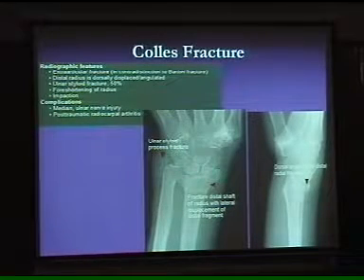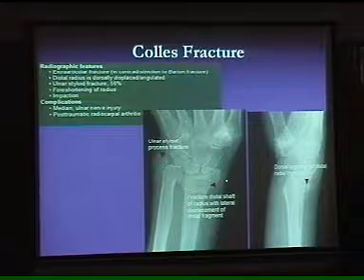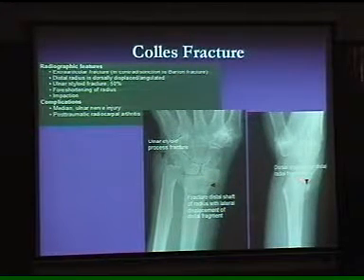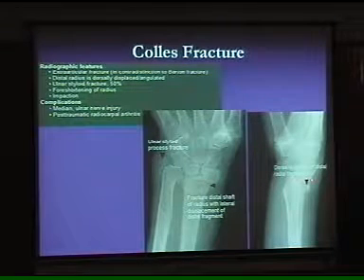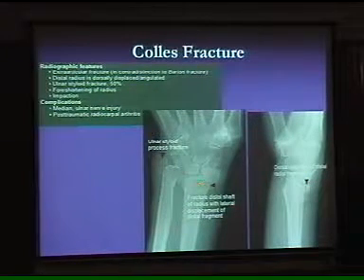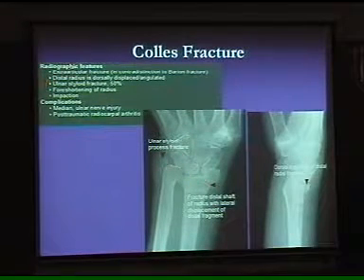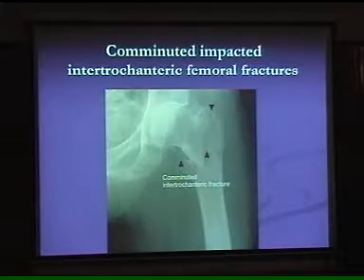I'll just run through the slides. That is another most common fracture, which you call the Colles' fracture. The diagnostic sign is that the distal segment goes posteriorly. When you do the lateral view, the distal segment goes posteriorly, and that is the impaction of it. Appreciate this line. There's a lucent line over there, and these are all the diagnostic signs you can appreciate over there.